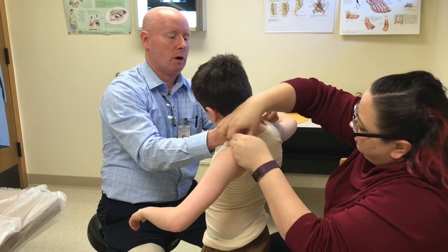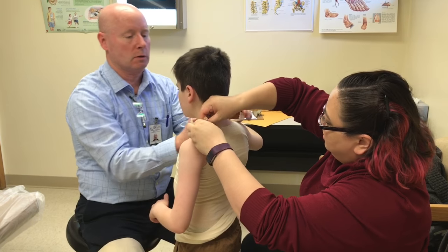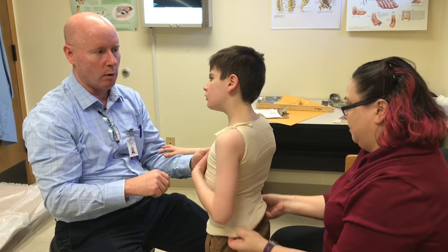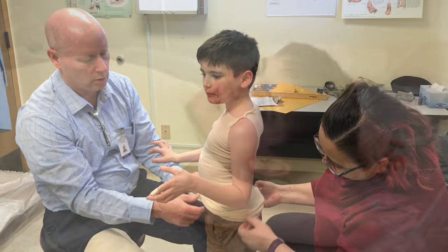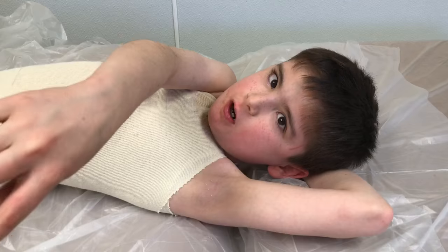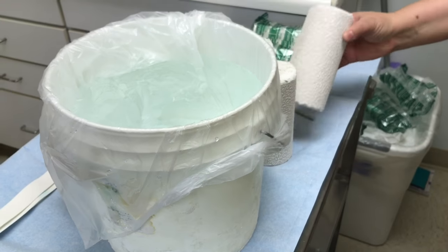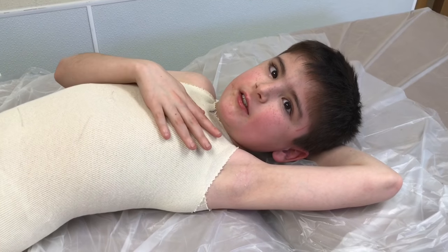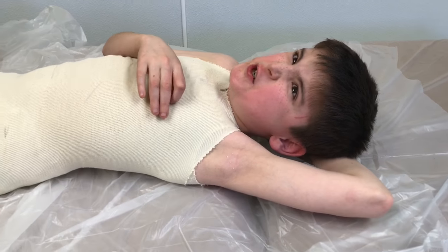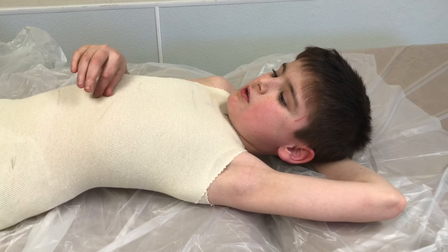We're going to have it high on your arms on purpose so we try to keep you reasonably clean. If you're just a little messy when we get done, mom can just wipe you off with a washcloth. We'll probably want to lose the hand covering but keep the undershirt. They're getting ready to put on the plaster. It's like papier-mâché — that's to keep you nice and dry and clean.